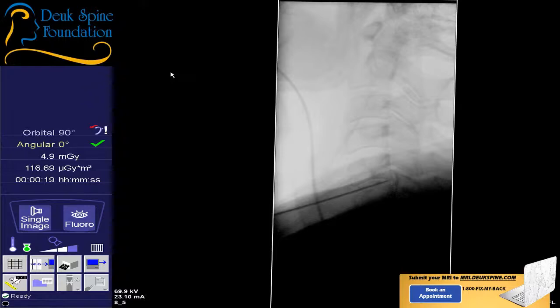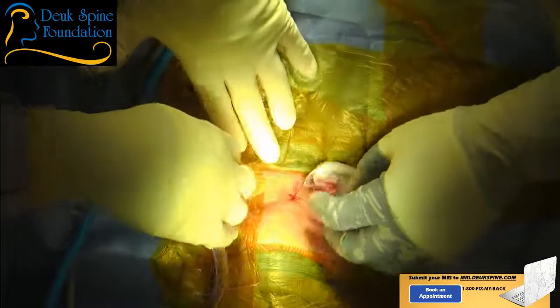If you adhere to the old beliefs about MRIs, that it has to be a big herniation to cause symptoms, hers don't look that bad on the MRI, but they are bad. And we're seeing evidence of that right now with X-ray and discography. So the discogram is a far better test to look at patients' discs and to look for the tear. Which, by the way, it's the tear, the annular tear, that is the cause of all of the neck pain or back pain, thoracic pain. We call it axial spine pain.